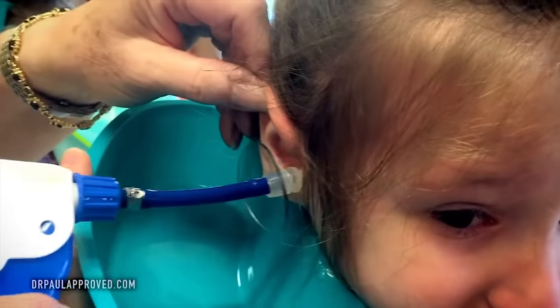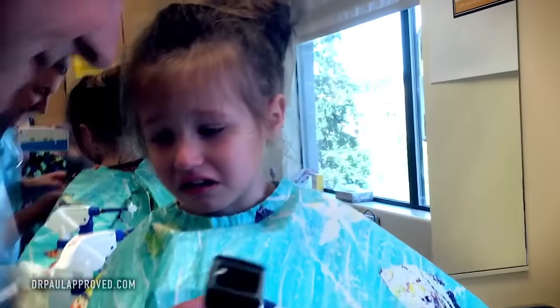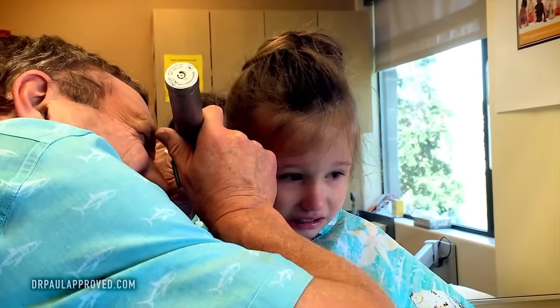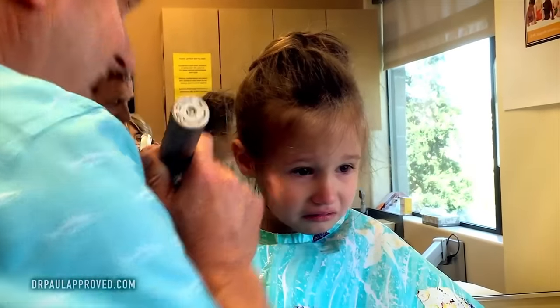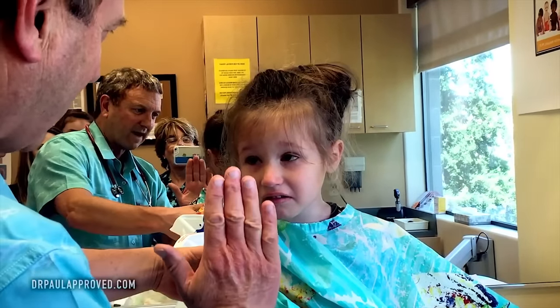What do you think? That is... Mommy. That's great. You went super. I think that might be it — let me take a look. We're going to look. This is just the light. See? That's just a little light. That doesn't hurt. We'll just take a look in here. You have the cleanest ear in town now. You have a clean ear.